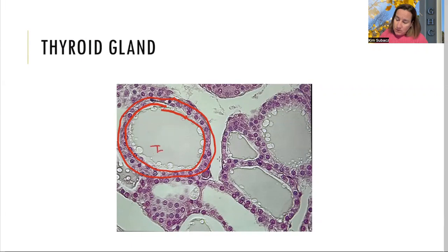So T3 and T4 are coming out of the thyroglobulin and iodine that's in this jelly-like colloid here in the middle. So you can tell that it's kind of jelly-like because if you look at the edges, this jello is kind of pulled away from the side on this follicle.